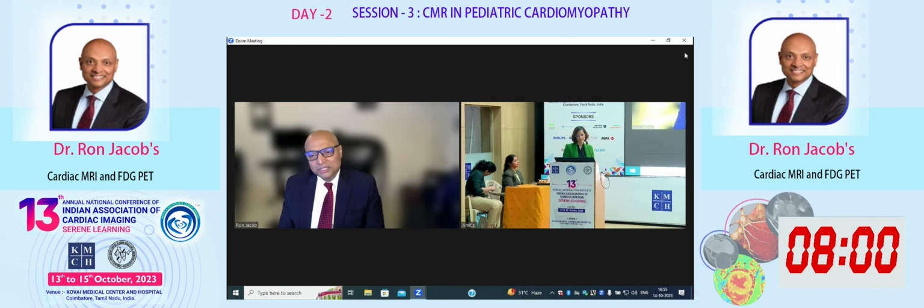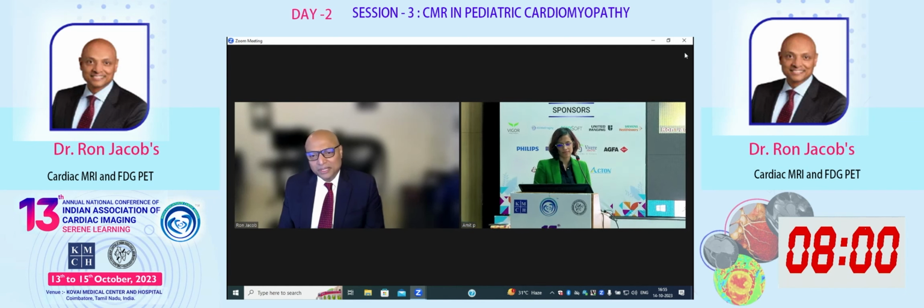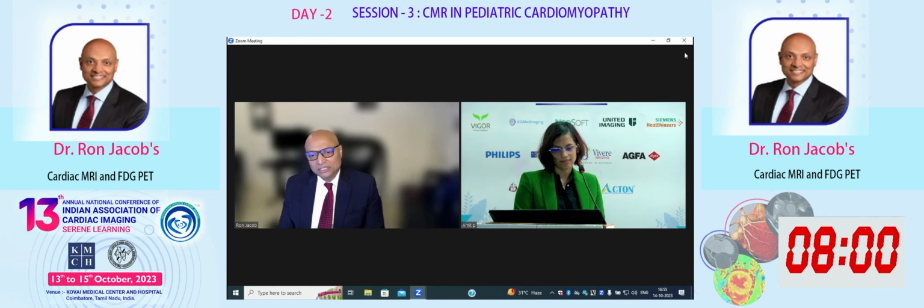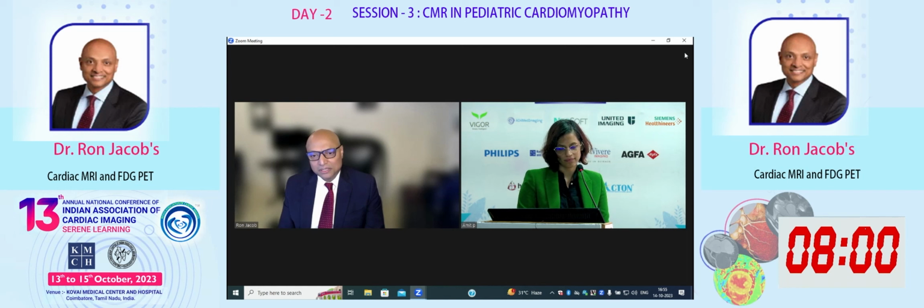We do maps routinely in almost all of our patients, but we've also spent a lot of time establishing our normals. We have a T1 phantom. So I think if you put in that work to make sure that your numbers are reliable and solid, and you know what your normal values are, then we've found it to be quite helpful.